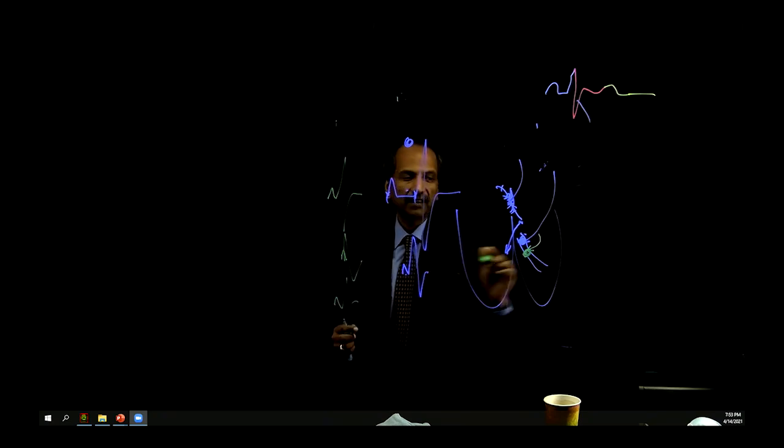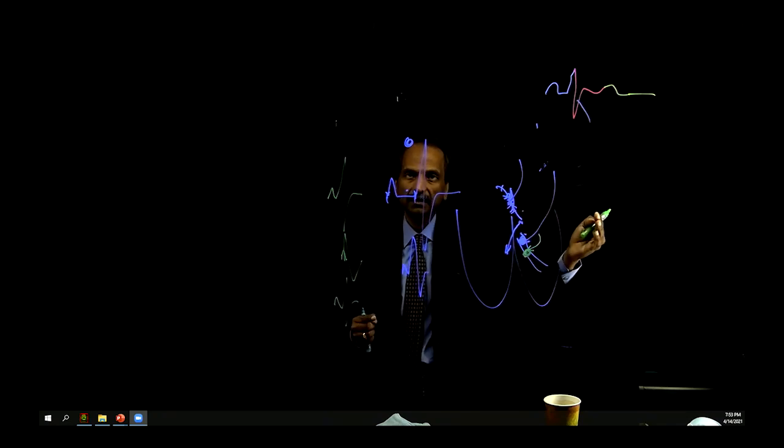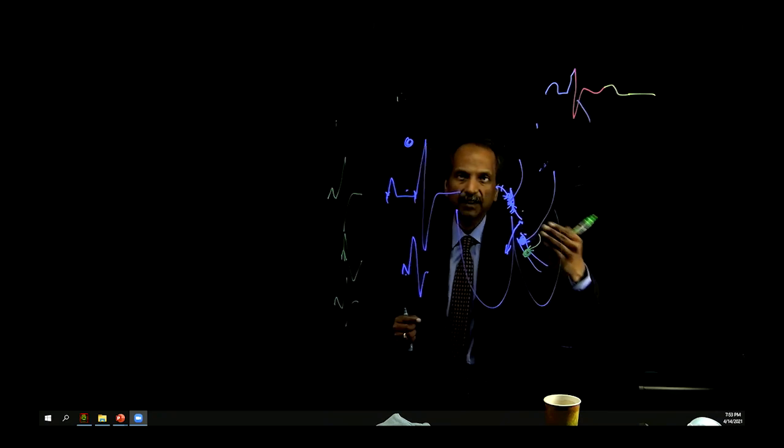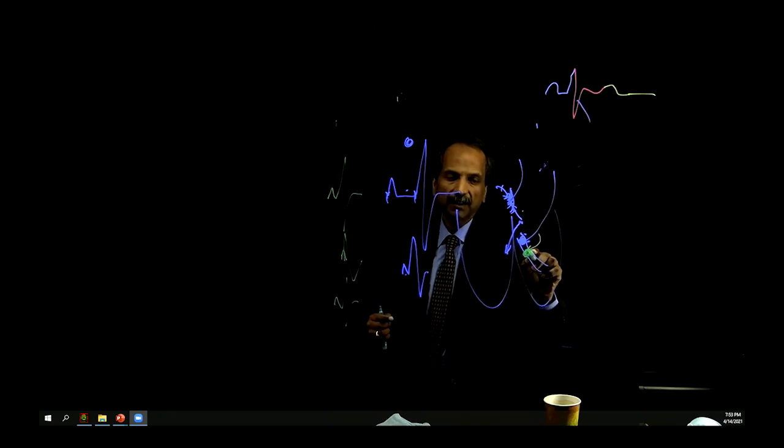No, but it tells you don't waste your time anywhere higher than that. Why doesn't that give us the site to ablate? One, a very difficult scenario where we actually have a re-entrant arrhythmia, and we have to use our other skills for circuit mapping and entrainment. But even with a focal source arrhythmia, anywhere below the focus will also produce the same match.